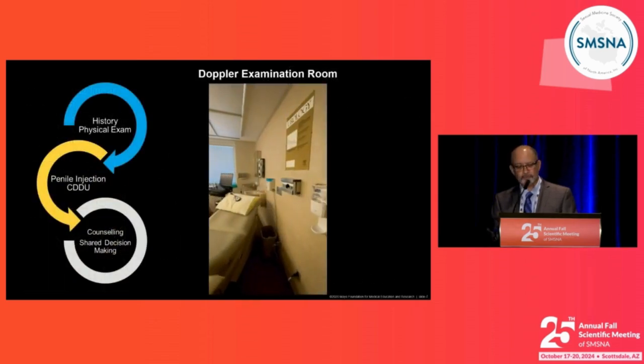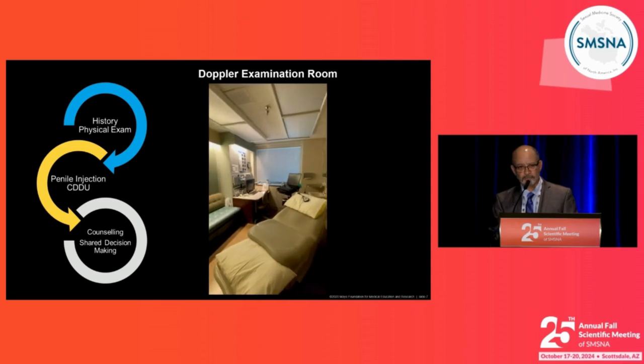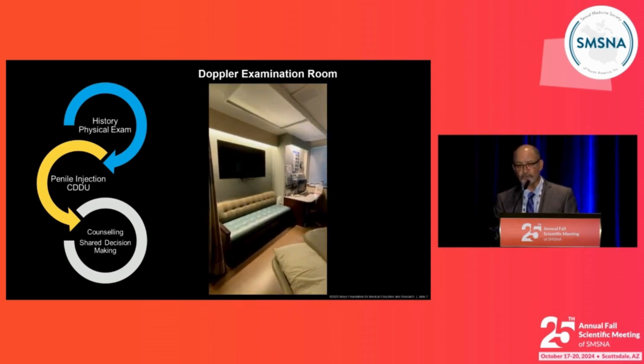The duplex Doppler room sits right next to one of my examination rooms. It's a comfortable place that I think the patients would prefer to be in rather than a radiology suite. It's staffed by 2 male nurses that work with me throughout the day on Testopel, Aveed, and other things.